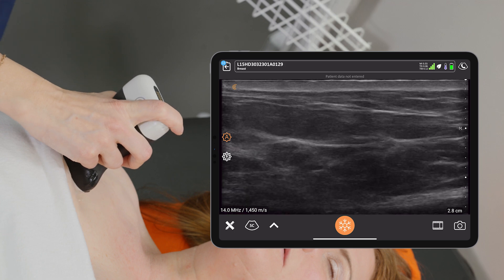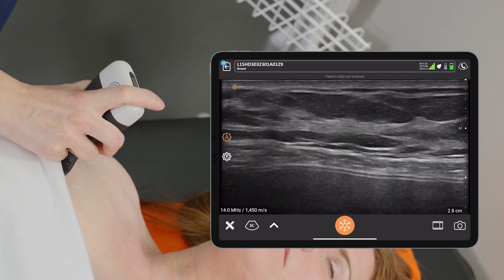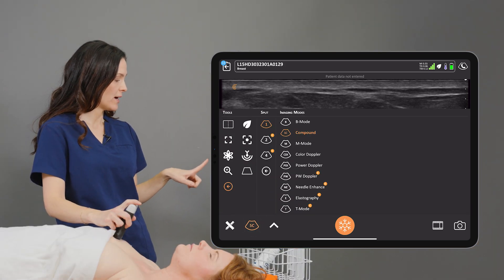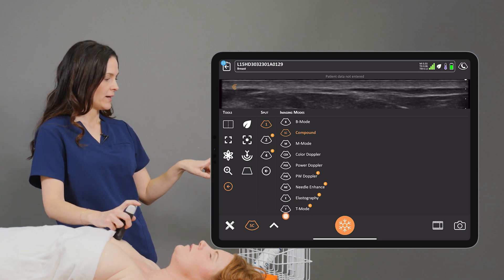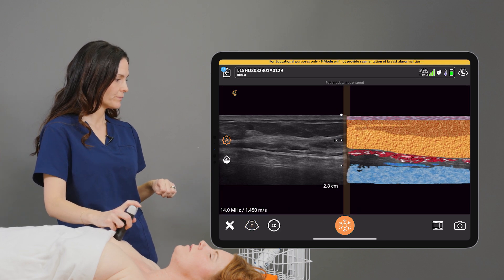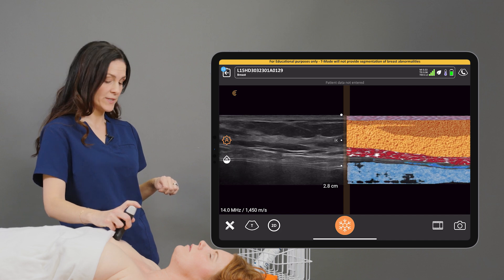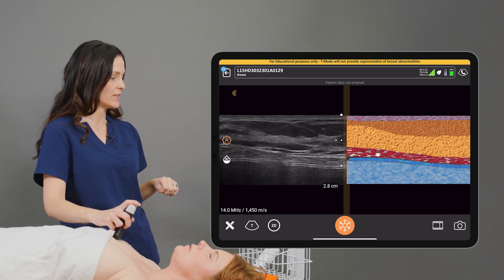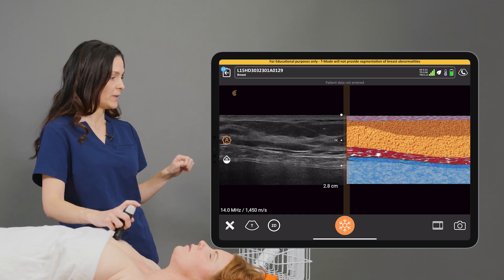I'll place my scanner down anywhere on the breast tissue. And to activate T-Mode, I'll select the Modes icon on the bottom left-hand side of the screen and select T-Mode. And now we can see a graphical representation of the tissue layers and tissue types next to our grayscale image.